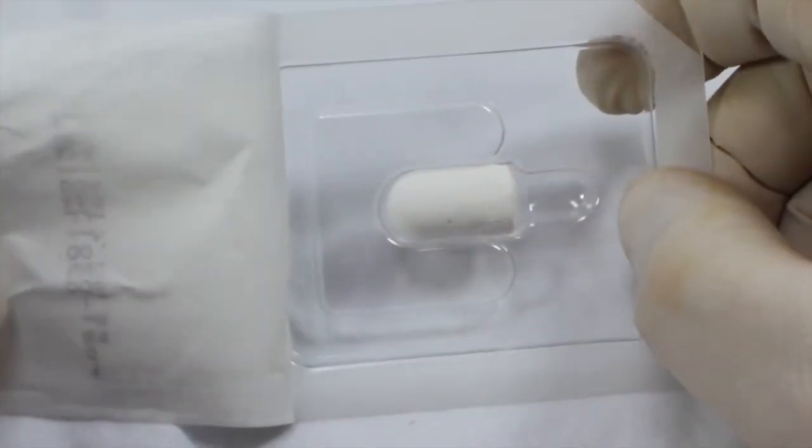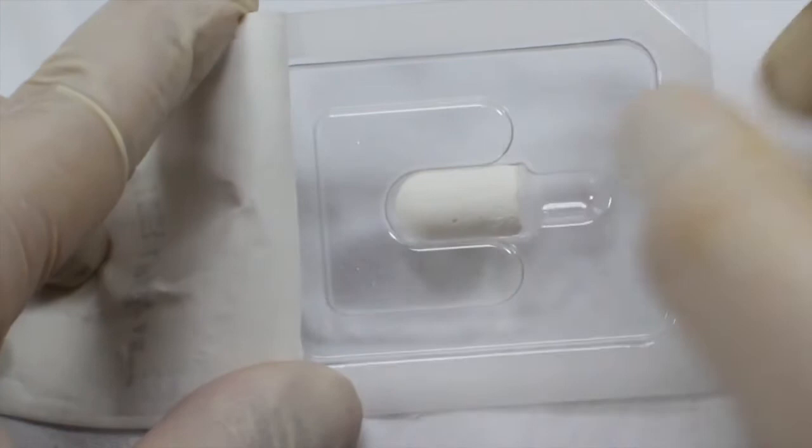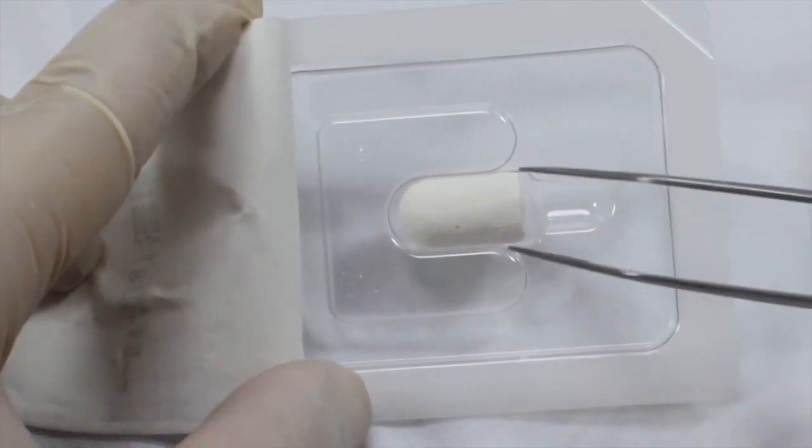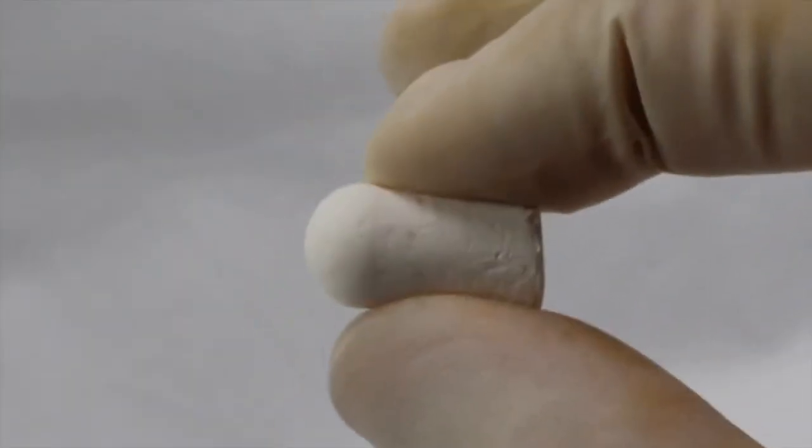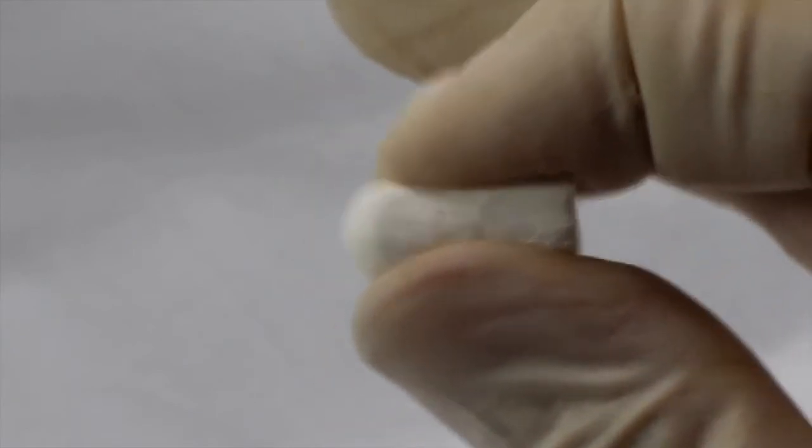After opening the individually sealed blister tray, we recommend that the OsteoGen plug be delivered dry into a thoroughly debrided socket. As demonstrated here, the dry OsteoGen plug is firm, yet remains malleable and can be shaped prior to placement. Here, this clinician is rolling the plug in order to taper it apically to mimic the shape of a tooth root.